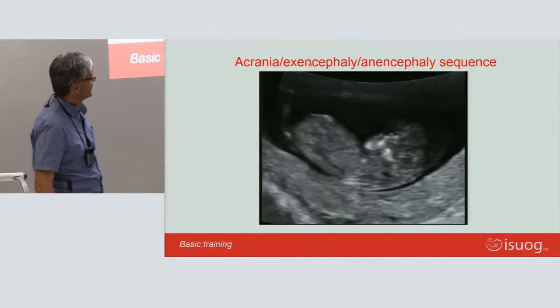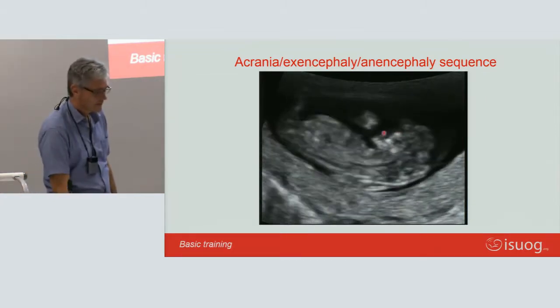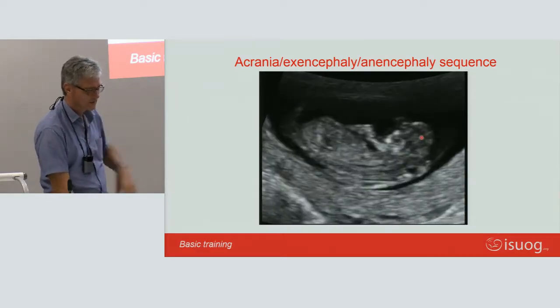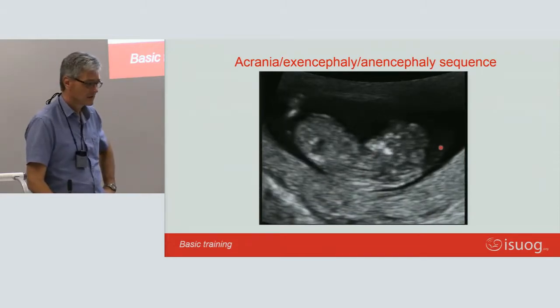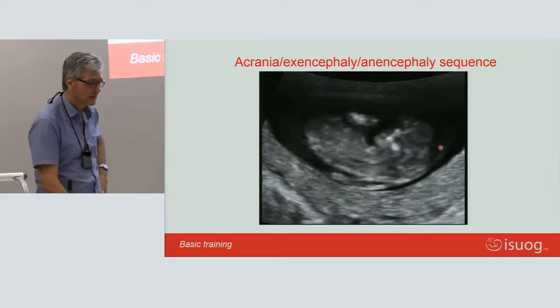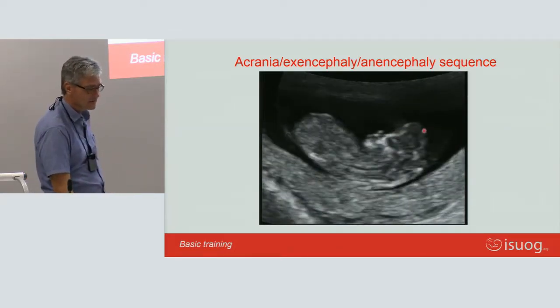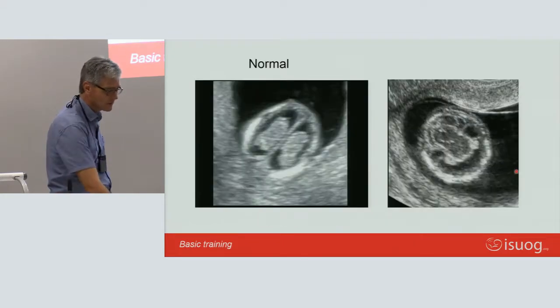And look, there the baby's moving, and now you can see it much more clearly, the face over here, and the brain actually floating around a bit. Which is why in the earlier days this was often missed, because if you have a quick look, you can measure crown rump length, and you really need to look and look again to make sure. And then you can appreciate that there's not a rounded vault of the brain.